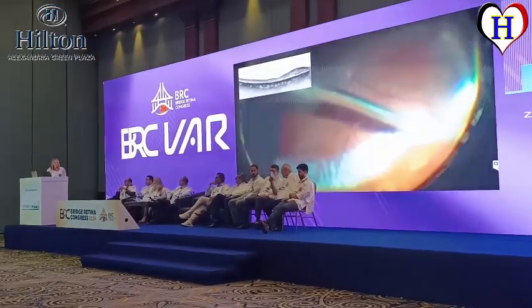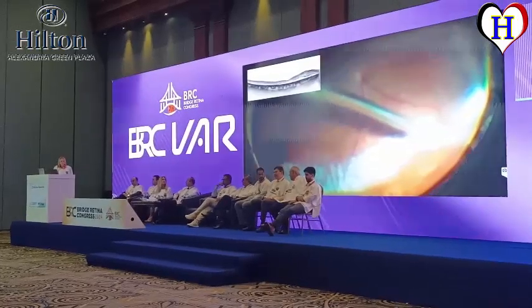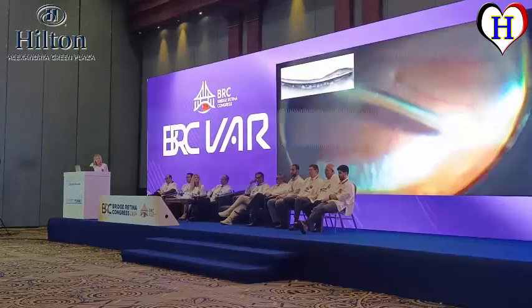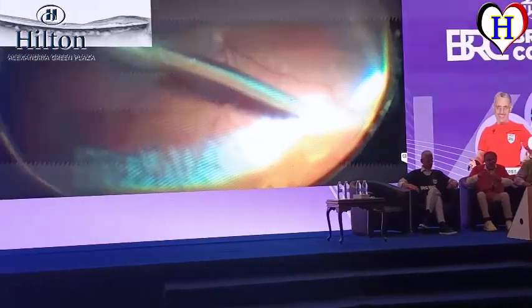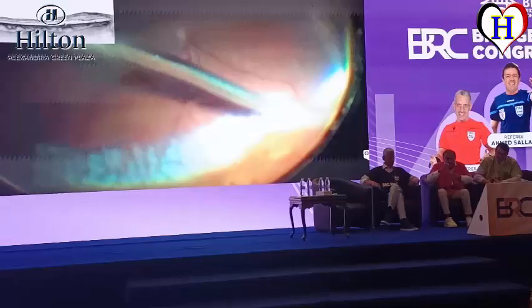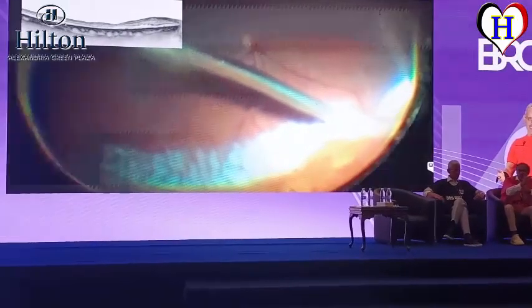Yeah. Well, how you manage it is the most important part. I think that's a teaching point for everybody. You have to protect the retina. Once you're doing vitrectomy, you always have perfluorocarbon to prevent any blood that might happen once you're going to the back part of the eye, and having good diathermy at the edges that you're going to cut. That's very important.